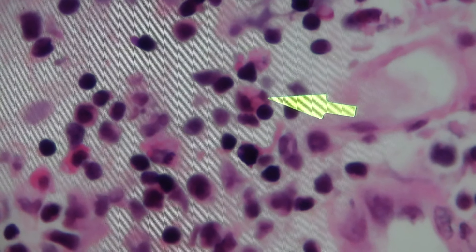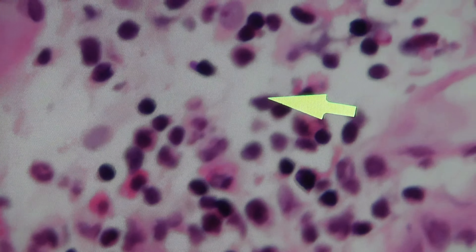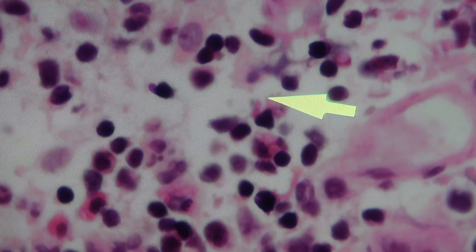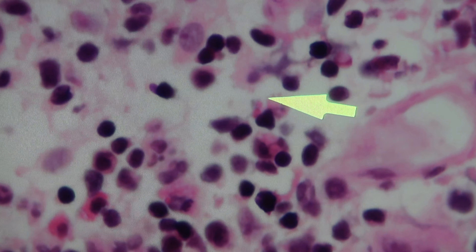Now when we go back to lower power and assess it overall, the question is: what is the overall damage here, both at the glomerular level and at the tubular interstitial level? So we're going to go back now to a lower power.